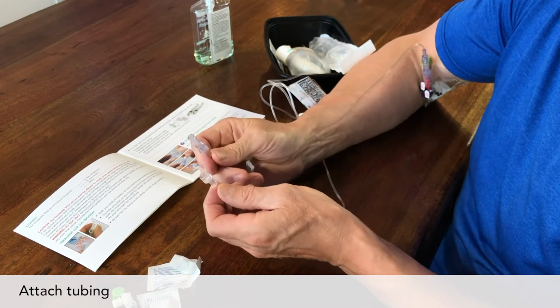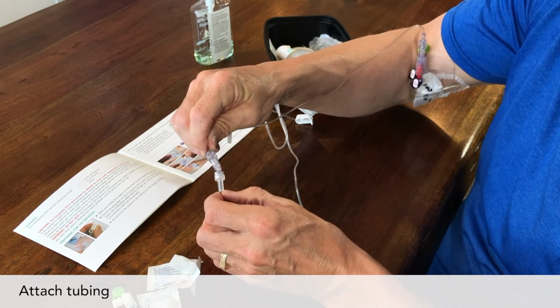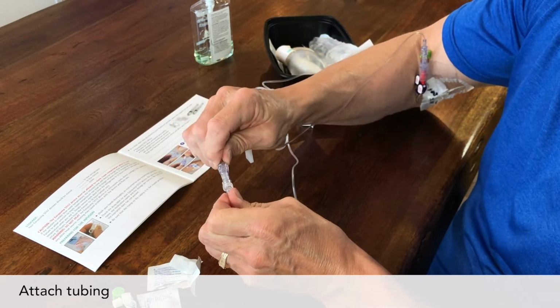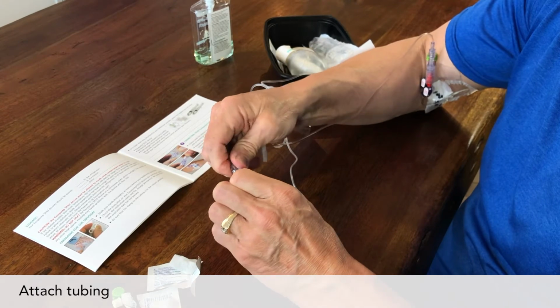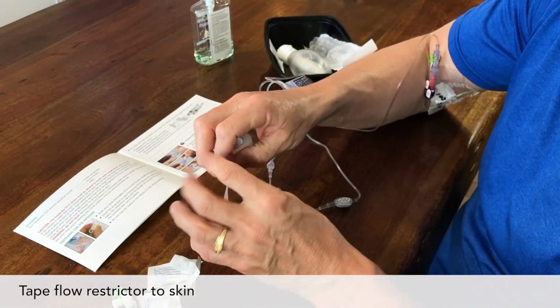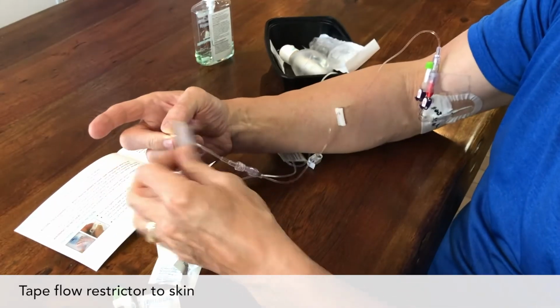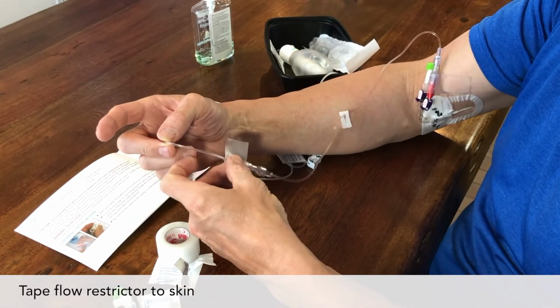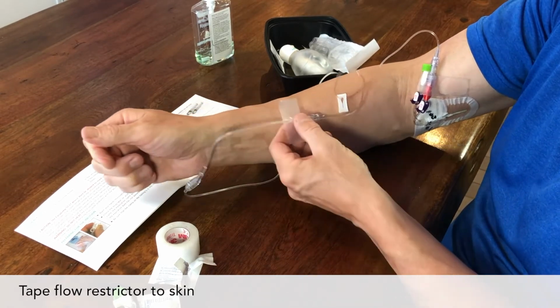Screw the end of the tubing onto your IV cap. Push and twist gently clockwise until it is snug. Do not over-tighten it. Tape the flow restrictor, that is the fat part at the end of the pump tubing, to your skin. Your skin temperature helps the pump run at the right speed.